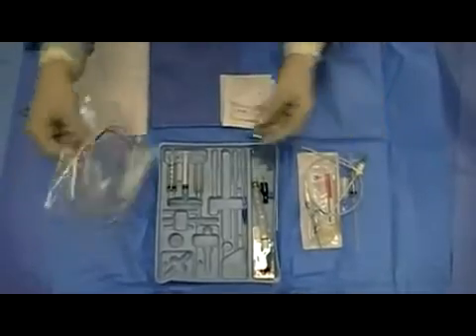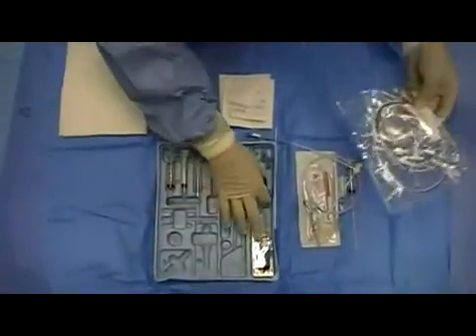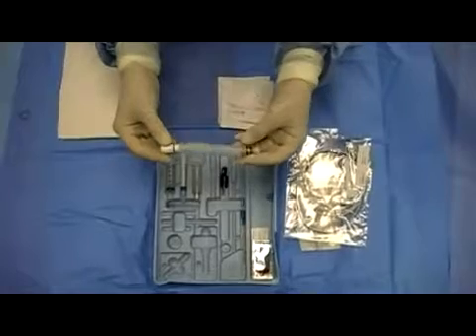Here are the actual pacer and the sterile wires, an alligator clip, and the catheter contamination shield.